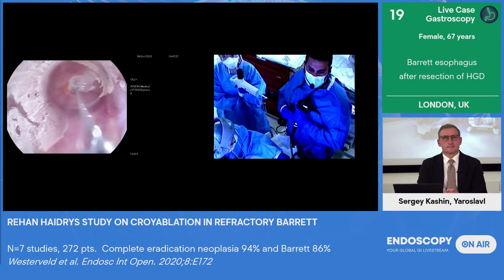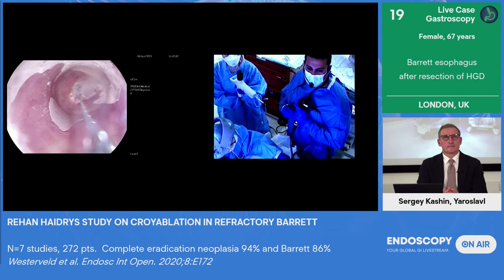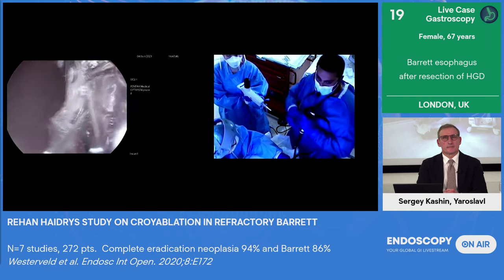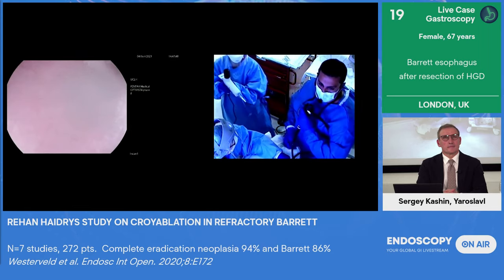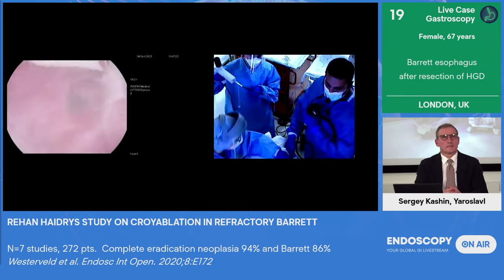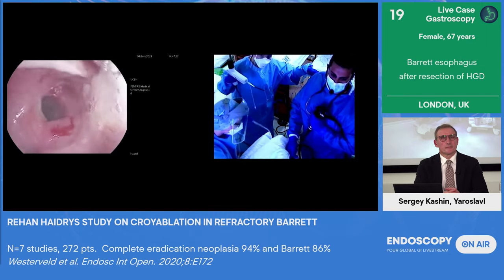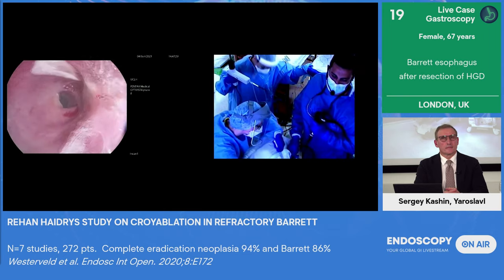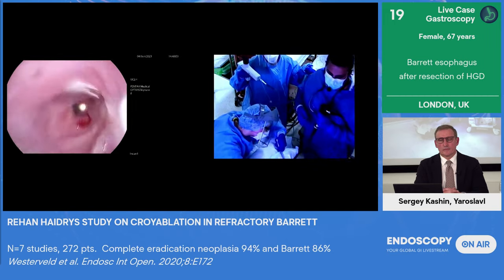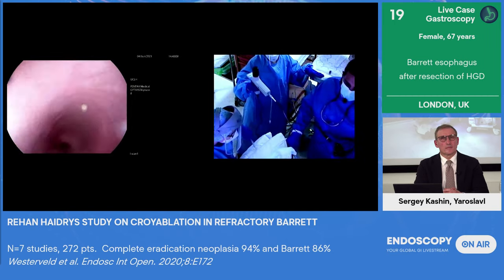So here, Sergey, what I'm going to do is treat that little island, and you can treat one area knowing that the freeze is going to spread over a surface area, and you're going to get good coverage of the entire Barrett's. Now, the other thing I've not touched on, Sergey, is the duration of treatment. In RFA, we talk about dosimetry in terms of joules. Here, we talk about how long we expose the mucosa to the nitrous oxide. And the current protocol is 8 seconds of exposure.